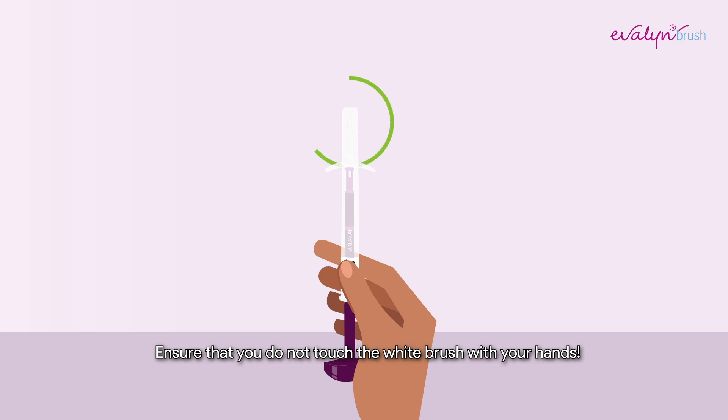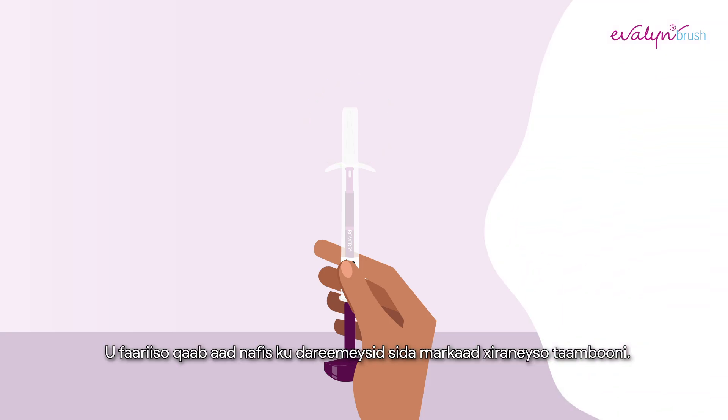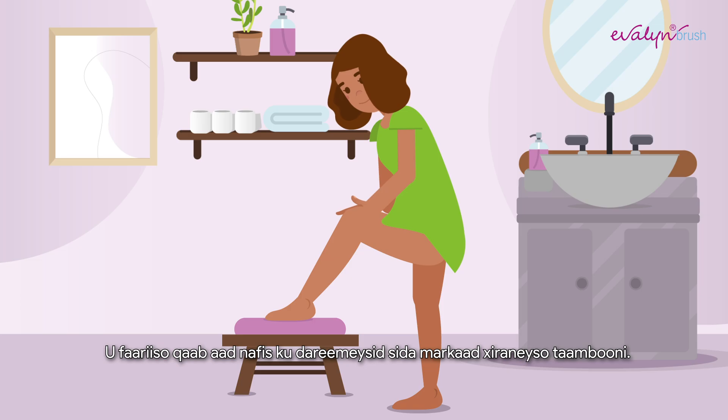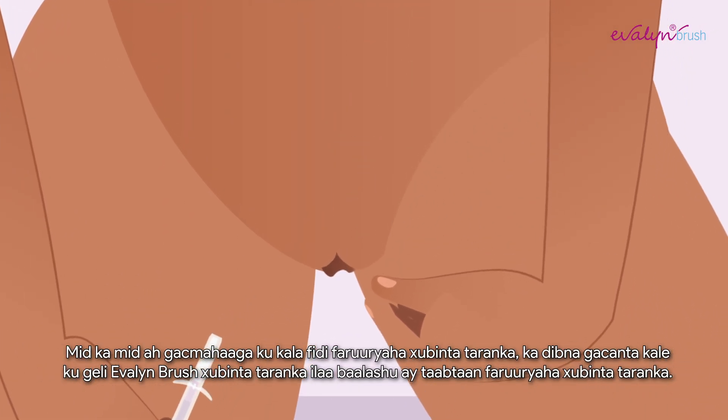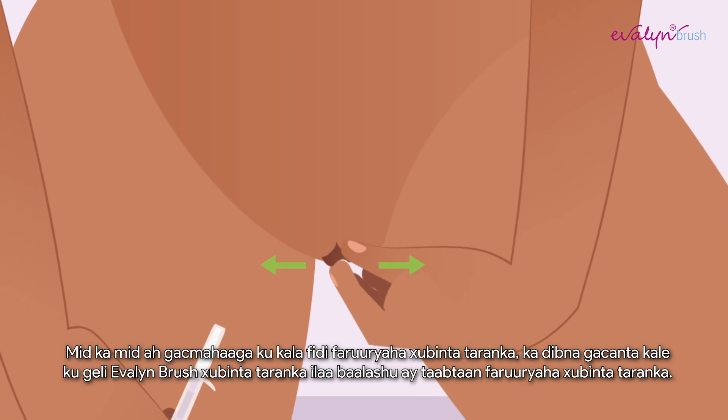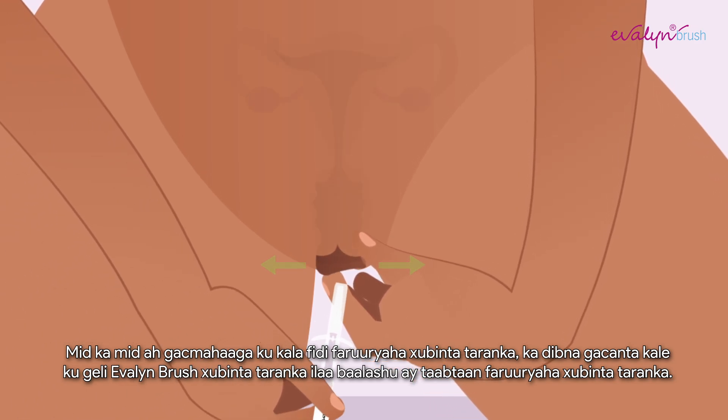Ensure that you do not touch the white brush with your hands. Assume a comfortable position, such as when you insert a tampon. Spread your labia with one hand and with the other, insert the Evelyn Brush into your vagina until the wings touch your labia.